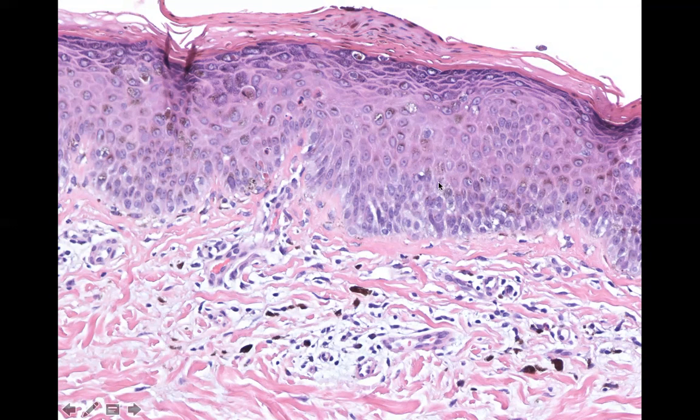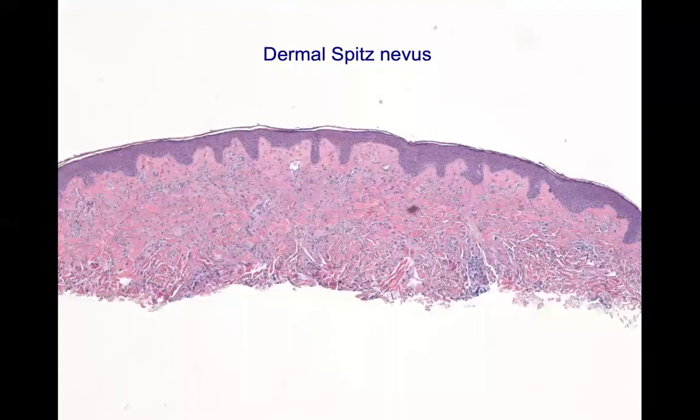This would be an atypical Spitz nevus. And your threshold for getting towards a melanoma would be determined by how many cells are above, how big is it, how well circumscribed is it, how much confluence you have versus if you start to form nests. So a lot of these are just a degree question, in which case there's inter-observer variability.